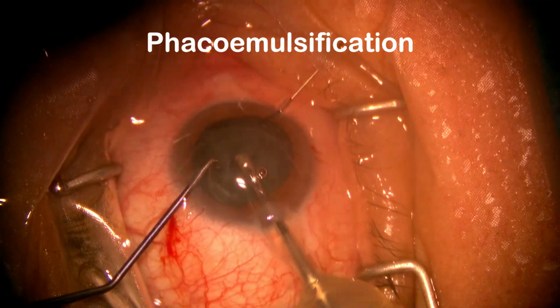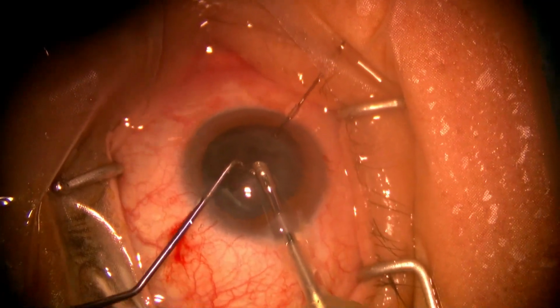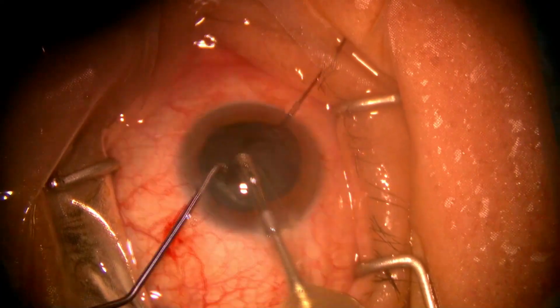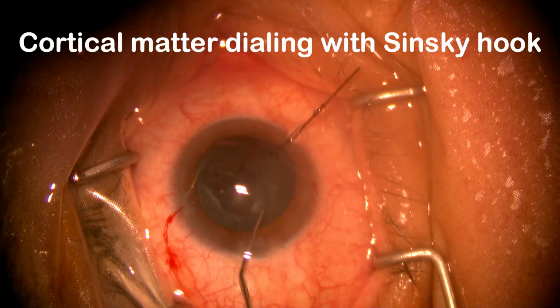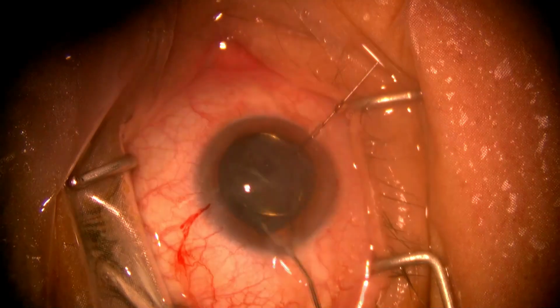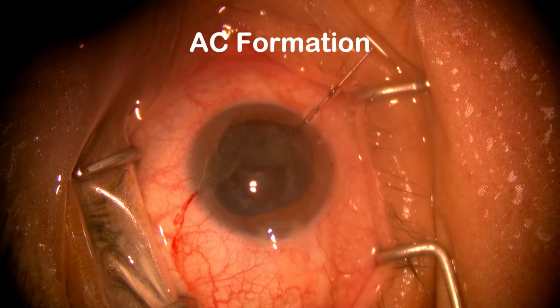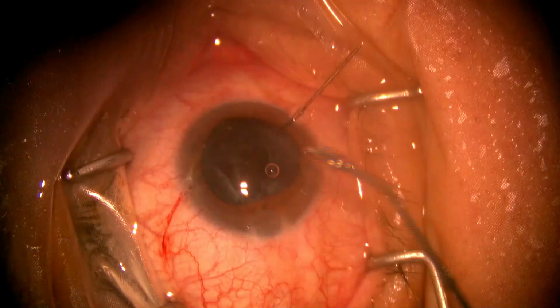After that, phacoemulsification of the traumatic cataract is being done as shown in the video. Leftover part of the cortical matter is being dialed using a Sinskey hook. Anterior chamber is formed. Leftover phacoemulsification is completed.